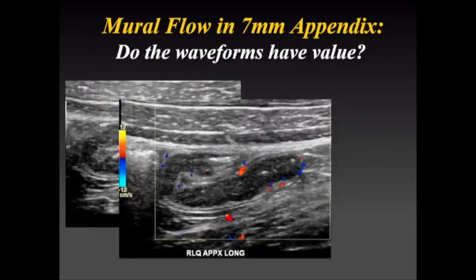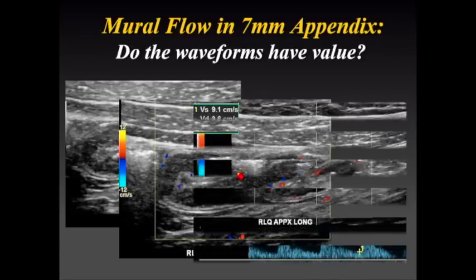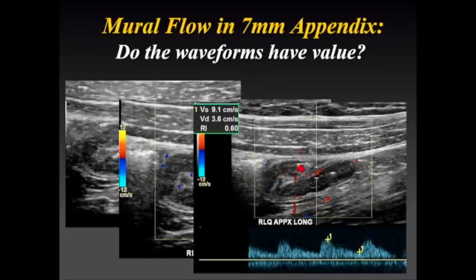And so when we look at these waveforms, we can measure them from the wall, and we can get a nice Doppler waveform. I'll just say parenthetically, the angle correction doesn't buy you any greater specificity. We angle corrected a whole bunch of these and non-angle corrected. So when you angle correct, if anything, the velocities are a bit higher. So it's not absolutely mandatory to angle correct, but if you can, we try to do it. Here we can see the velocities.